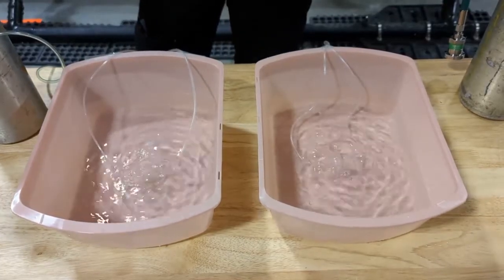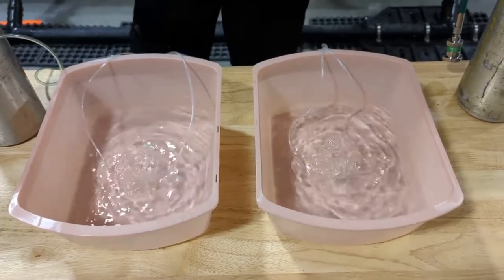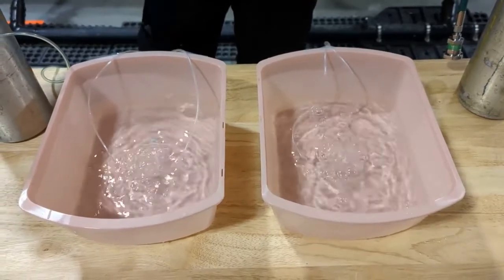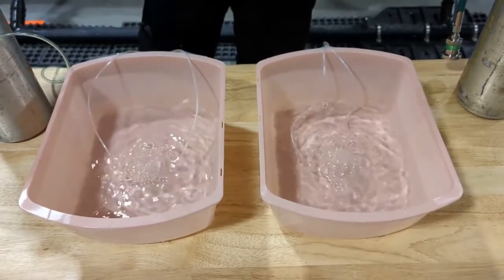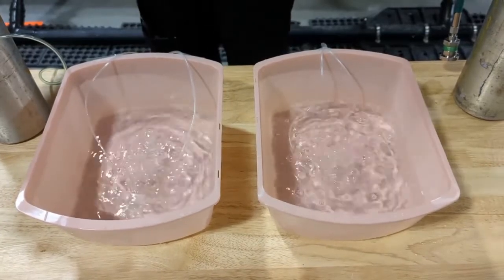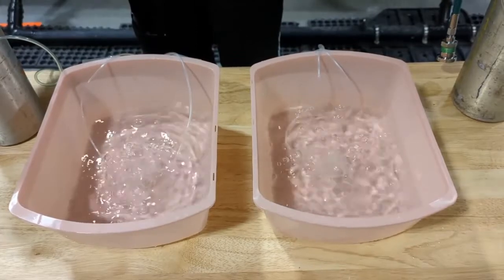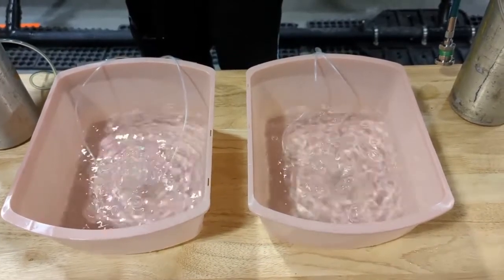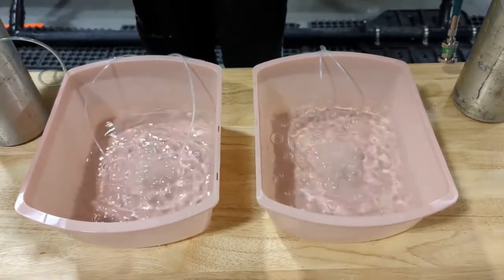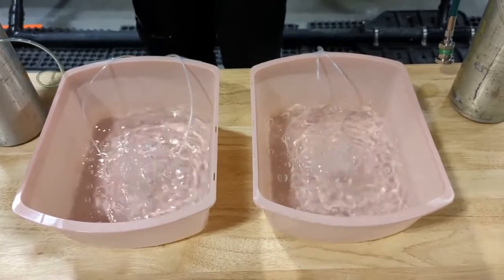2 liters. 4 liters. 6 liters. 8 liters. 10 liters. 15, and 25.